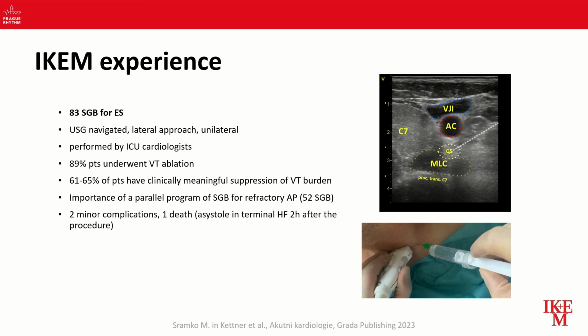You do only this one procedure, nothing else, and most of the patients develop Horner syndrome, and most of the patients decrease the symptoms, which we can often document even by bicycle ergometry, where you can see ischemic changes and the patient doesn't feel any pain. So it gives some reassurance to the operator that the procedure is done well, which reassurance you don't have in some critically ill patients.